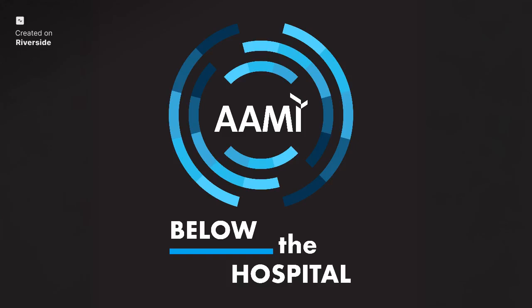And in my role, I work to align industry best practices and regulatory requirements with a strong emphasis on ensuring that IFUs are clear and helpful for the healthcare professional. It is crucial for maintaining high safety standards in SPDs. And I often emphasize the need for IFUs to follow what I call the 3 Cs. They should be clear, concise, and compliant. Clear IFUs help professionals understand instructions easily. Concise IFUs ensure necessary steps are outlined without unnecessary complexity, and of course compliant, because we have to meet all regulatory standards. Clear, concise, and compliant.